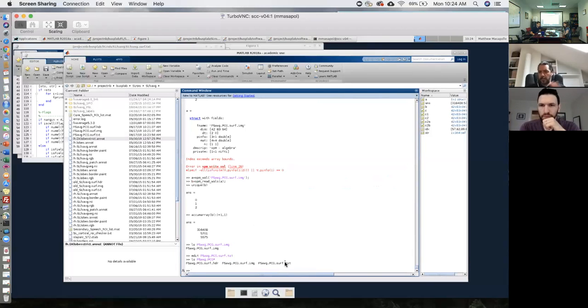Do you know how to do that for other scenarios, or do you have any questions on how? The fact that this was an actual, sorry, I didn't mention this, but the fact that this was an actual surface file didn't play any role at all in here. If this was an actual NIfTI file that was in MNI coordinates, you would have done exactly the same. Just take this file, look at the labels, the numbers that you want to create, and create a new file that has ones for those voxels and zeros for everything else.